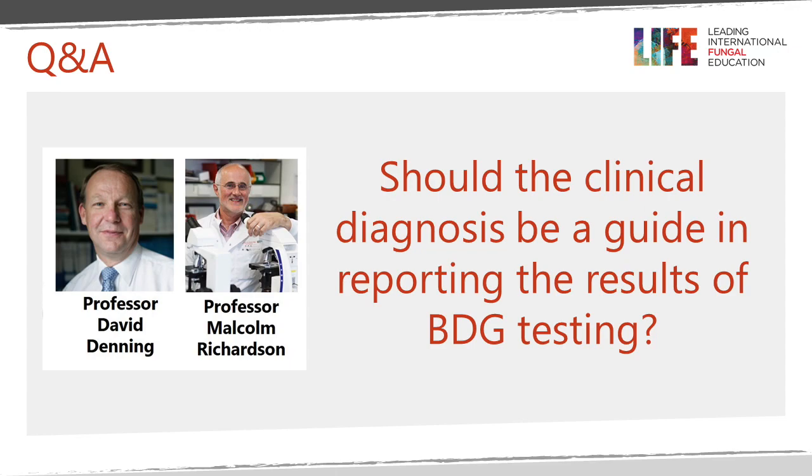There's been a lot of interest, hasn't there, over the years, and I think the companies have obviously taken this on board to a certain extent, where a single sample can be tested, as opposed to filling the whole plate, just to reduce the costs. But I just noticed the other day there's a paper now from Associates of Cape Cod where the Fungitell test is now available.